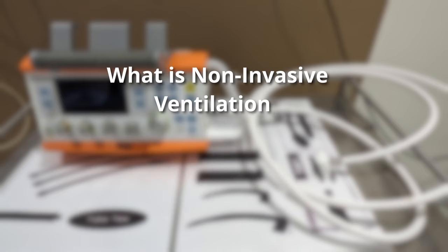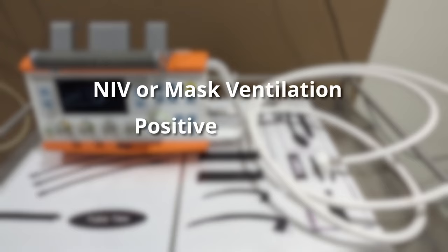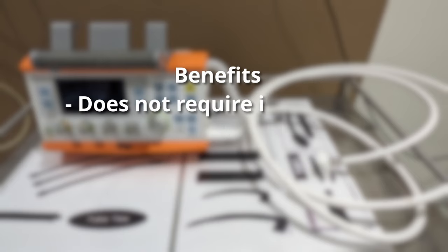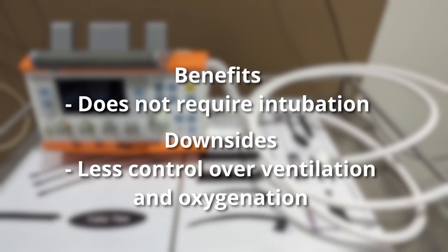So what is non-invasive ventilation? Non-invasive ventilation, sometimes called mask ventilation, involves the direct delivery of oxygen to the lungs via the use of positive pressure, without the need for an endotracheal tube. The benefits of this style of ventilation is that you don't need to intubate the patient, which carries inherent risks. However, it doesn't allow for as great a control of ventilation and oxygenation as invasive ventilation does.